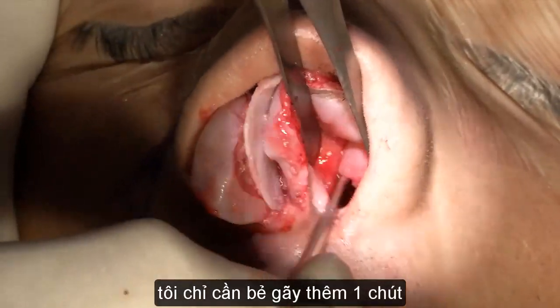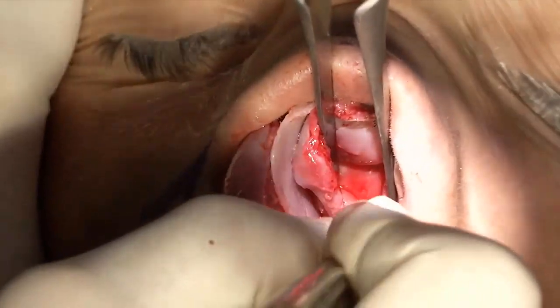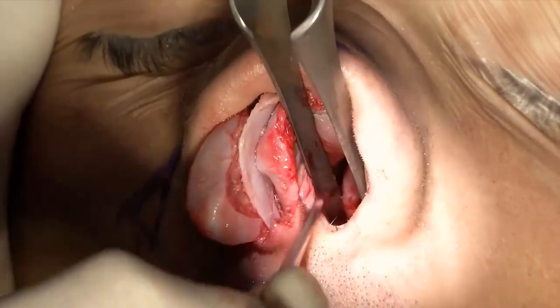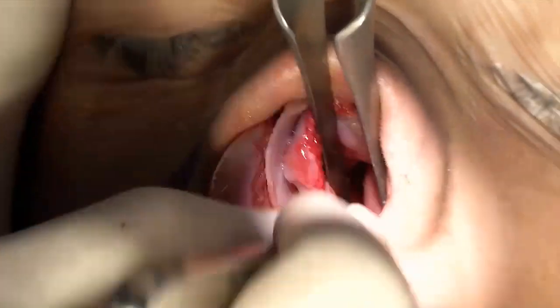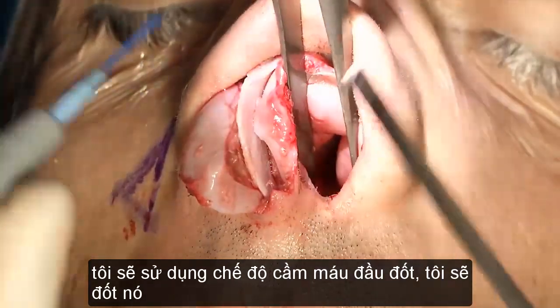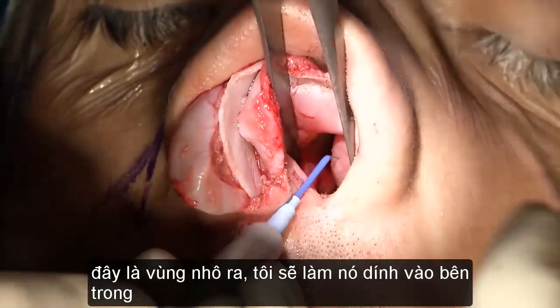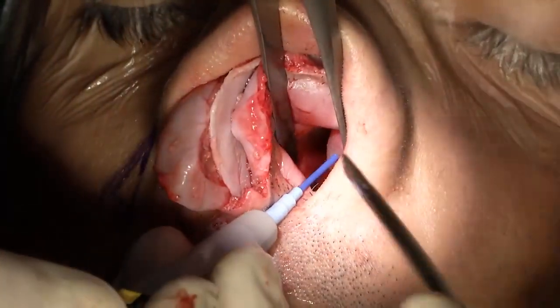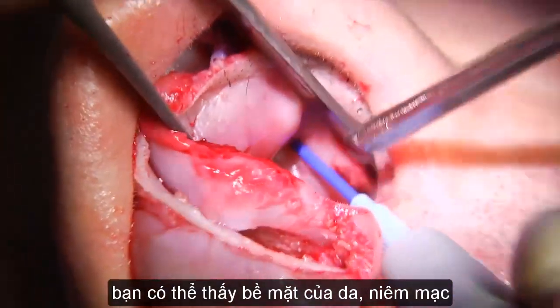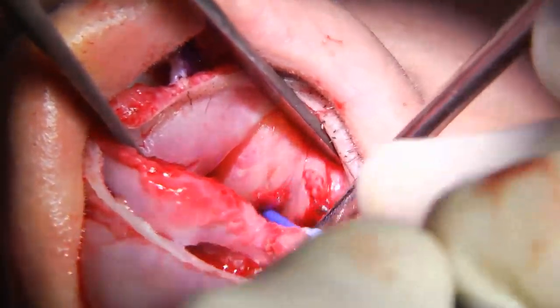I need to break this a little more. I know it's not easy to see this. So once I've done this, I will use my coag tip. I will raise the coag thing. This is a Valley Lab. I will stick it inside. You can see it blanches the skin, the mucosa, sorry. It behaves like a thermage kind of thing.